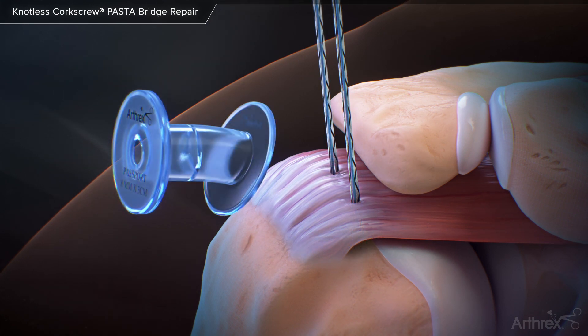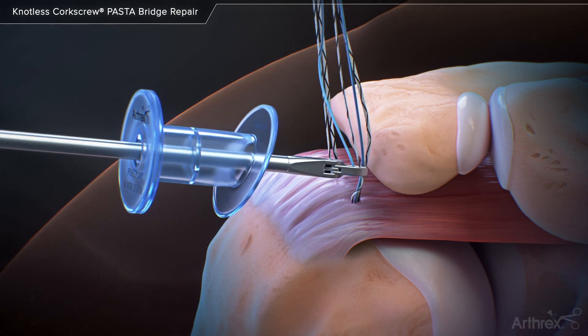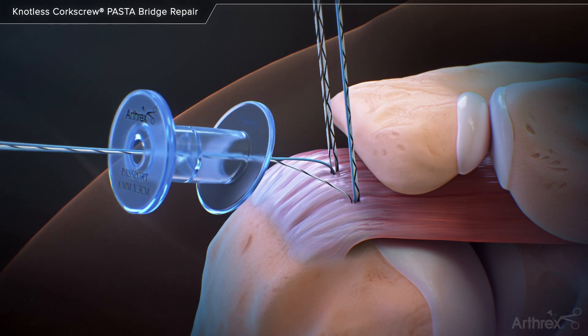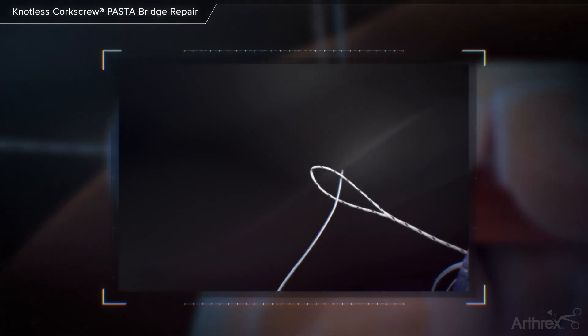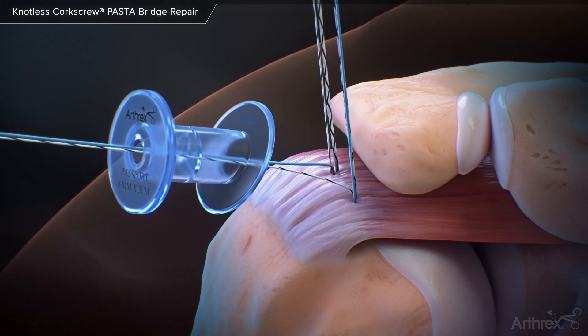Create the knotless interconnected bridge construct by retrieving a repair suture and then the looped round fiber-link tail from the opposite anchor out of the lateral portal. The tapered tail of the repair suture is loaded into the loop and folded at the ink mark. Pull the tape section to shuttle the repair suture into the anchor locking mechanism.